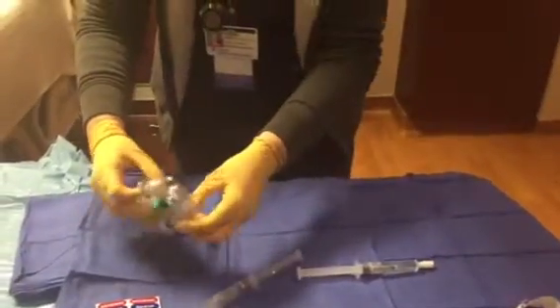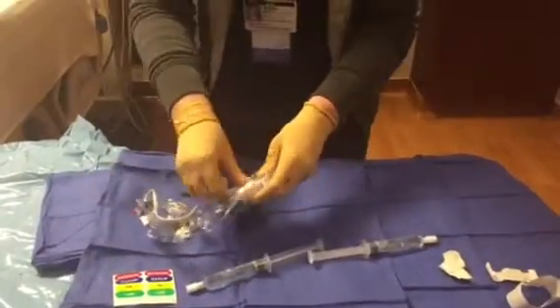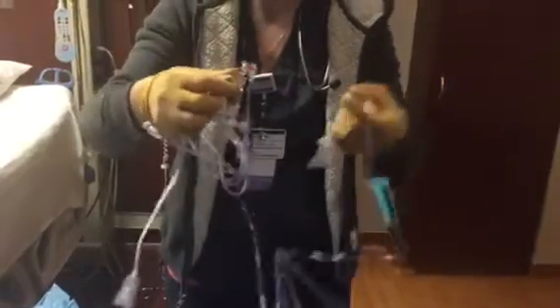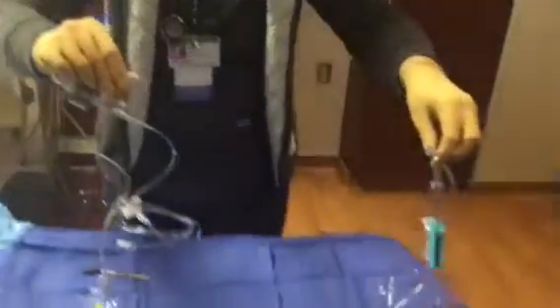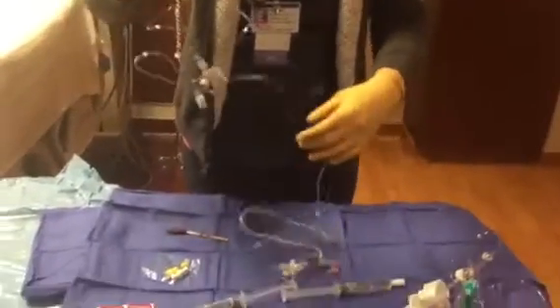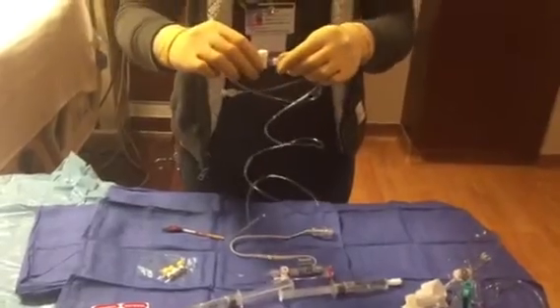Opening the pressure line — a couple of things right off the bat: you'll notice there's a spike, like you would normally use to spike a half-liter bag. You can disregard that altogether, because when flushing this line and when it is hooked up to somebody's brain, having it connected to a saline bag runs the risk of flushing fluid into the brain, which is a big no-no.